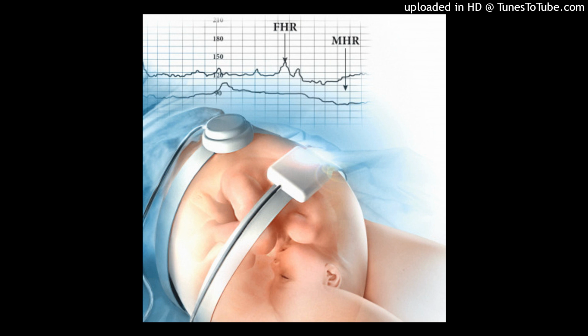Internal fetal monitoring requires a fetal spiral electrode (FSE) to record FHR and an intrauterine pressure catheter (IUPC) to document UA. Internal monitoring is referred to as direct or invasive fetal monitoring because this method requires cervical dilatation, usually 2 centimeters, and ruptured membranes.